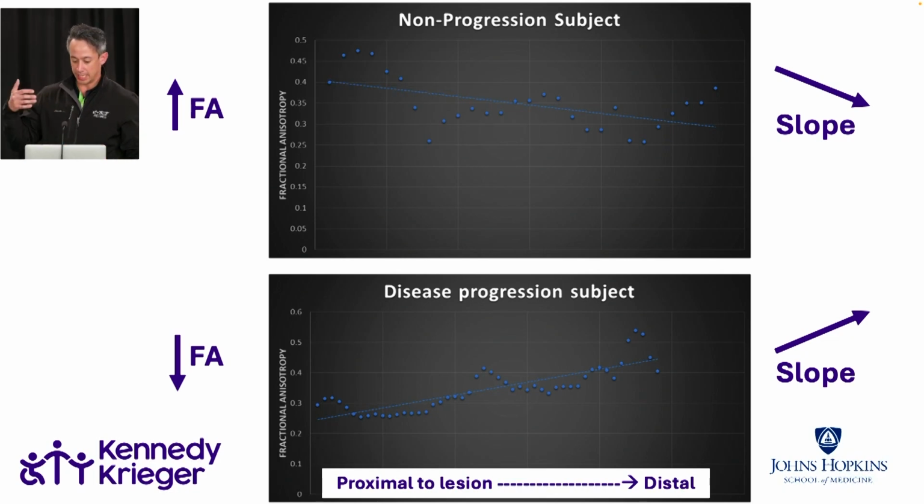So, thinking about clinical tools, are there things that we can do in addition to just the classic MRI sequences that can tell us something about how at risk a patient is and whether or not we should be thinking about gene therapy or transplant or enrolling them in a clinical study for that matter?